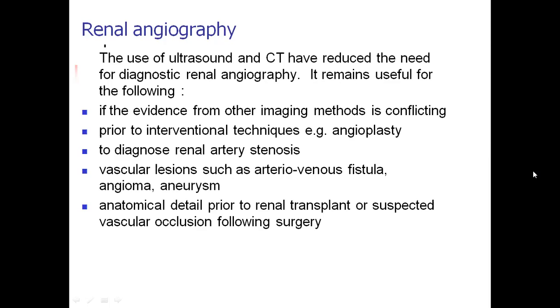It remains useful for the following: if the evidence from other imaging methods is conflicting; prior to interventional techniques such as angioplasty, to diagnose and confirm the degree of renal artery stenosis; to search for vascular lesions such as arteriovenous fistula, angioma, or aneurysm; and to estimate anatomical detail prior to renal transplant or suspected vascular occlusion following surgery.